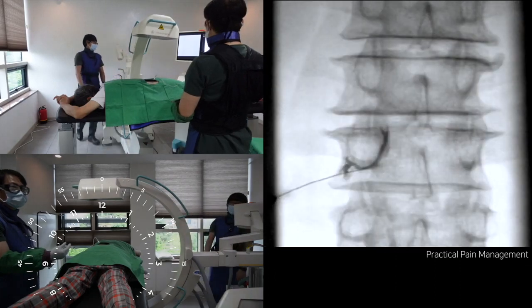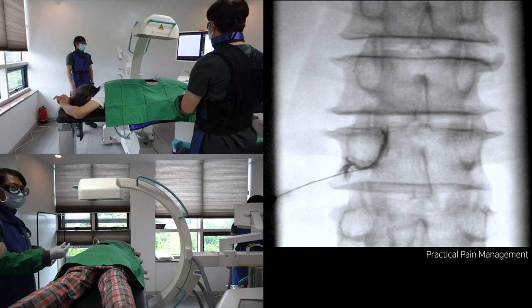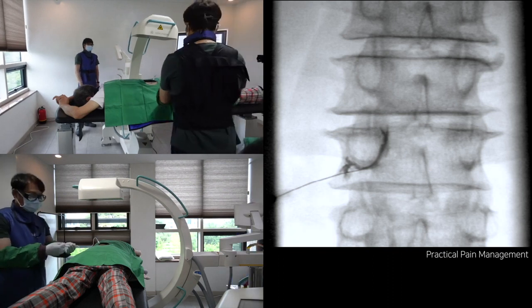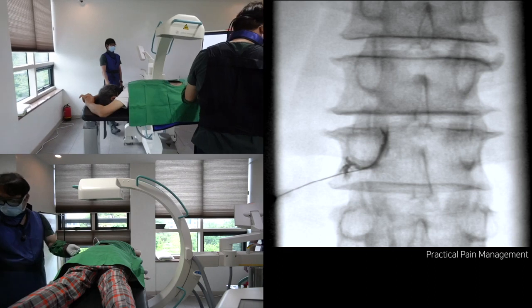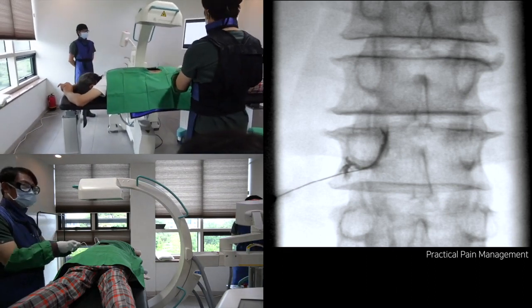Let me turn to an AP view. Please watch the side view of the C-arm tilting. Usually I must tilt the C-arm caudally in the mid to upper lumbar spine. On the contrary, I incline the arm cranially in the lower lumbar spine. Once again, I asked my patient to ease the muscle tension, which also helped reduce little tension.